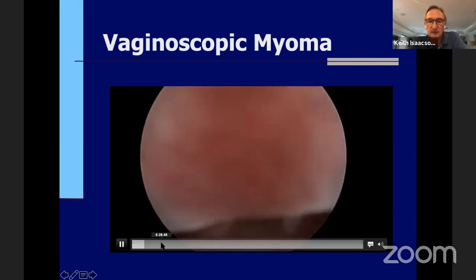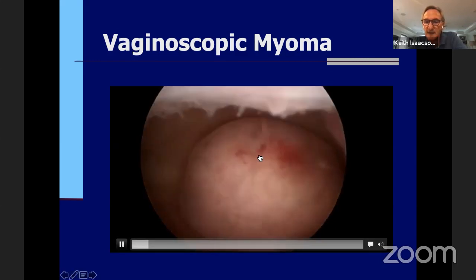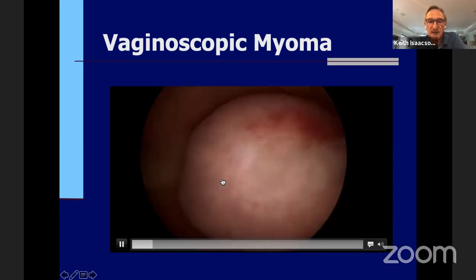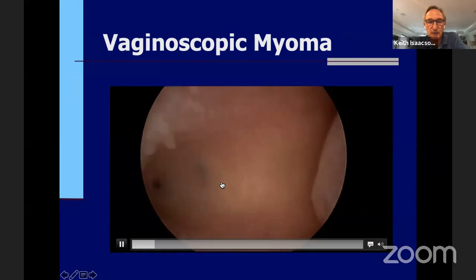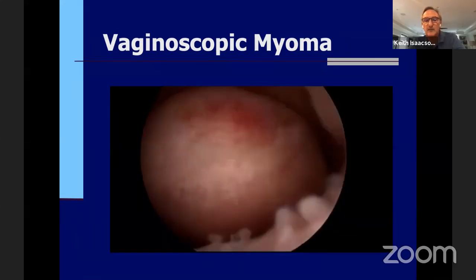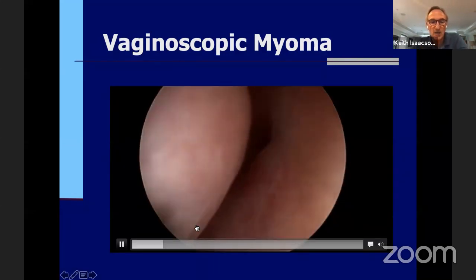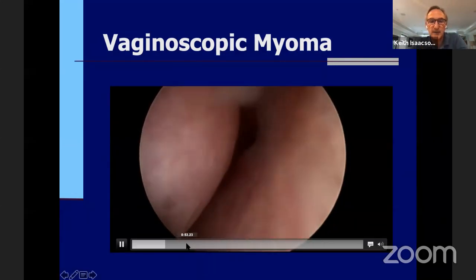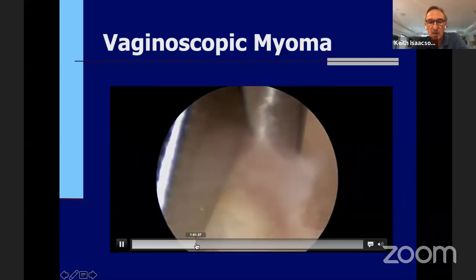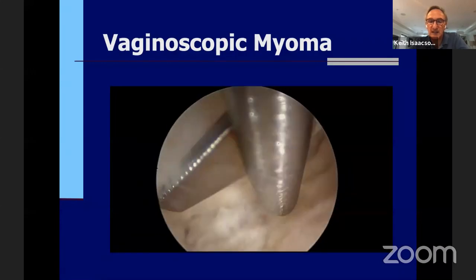You'll hear us talking to the patient, and you look at this, and this is a fibroid in there, and you're saying, it's so tempting to get this out, and all I have to do, look at both ostia, is disconnect this fibroid from the myometrium with the scissors. And I'm going to fast forward this a little bit.